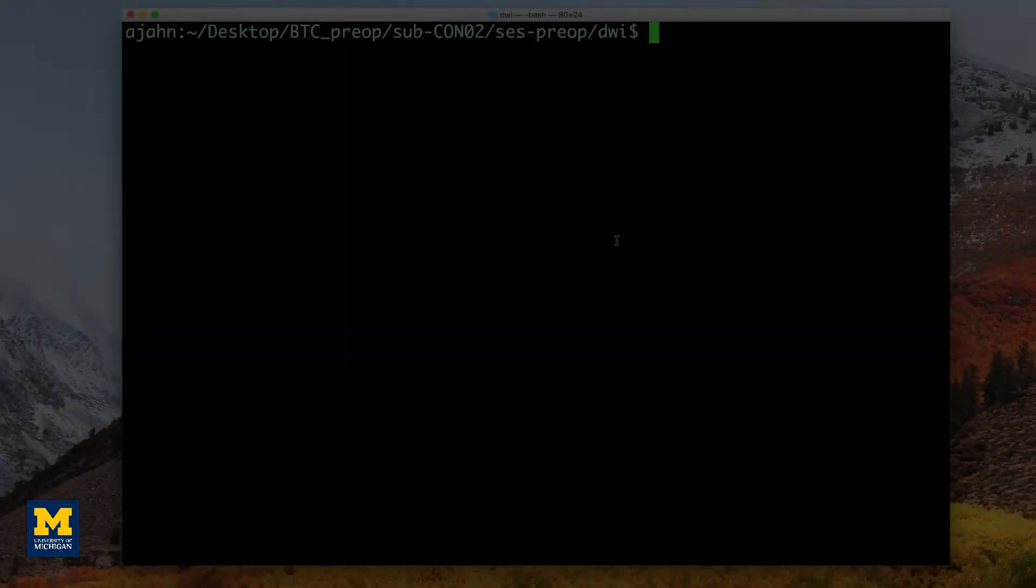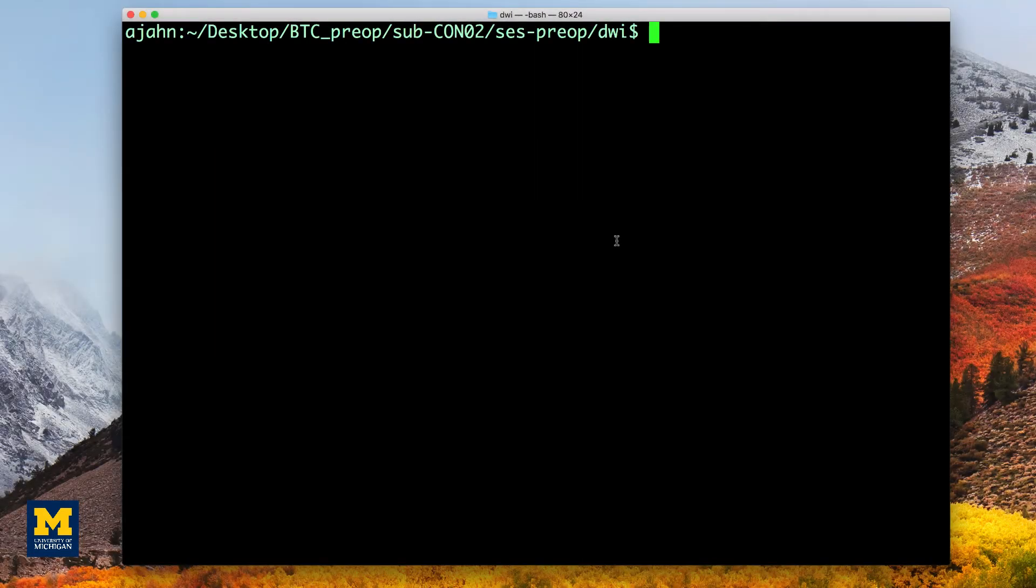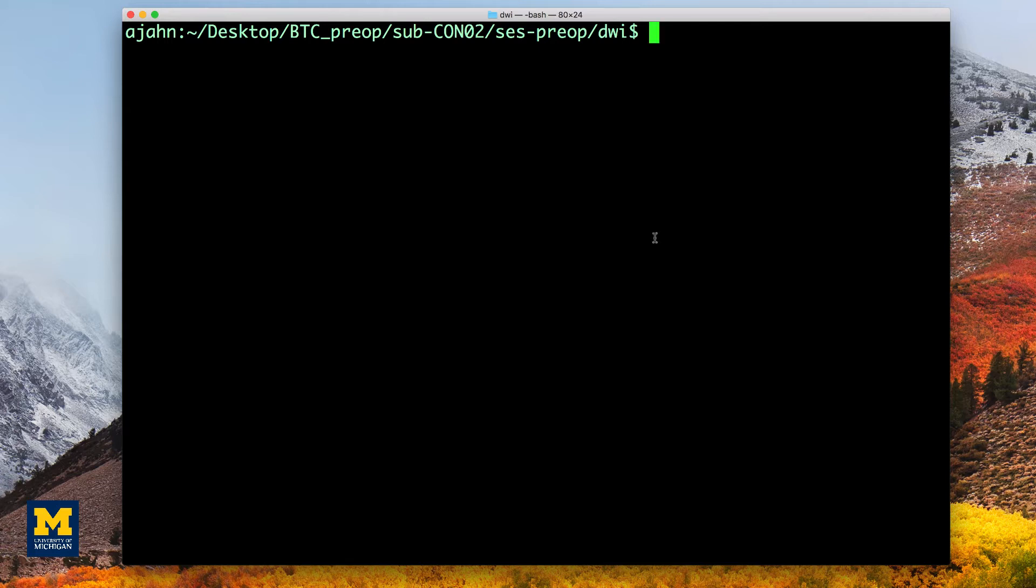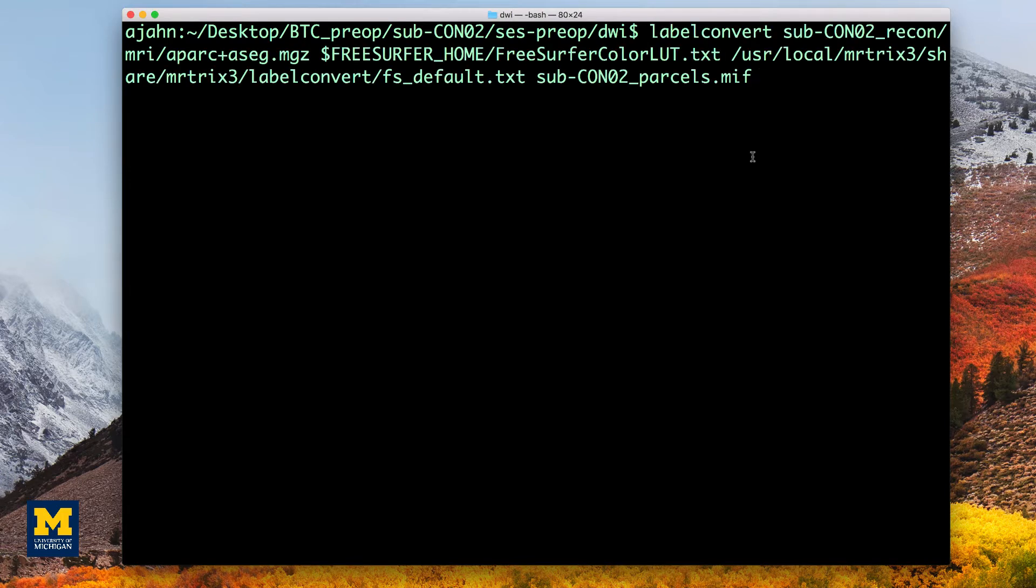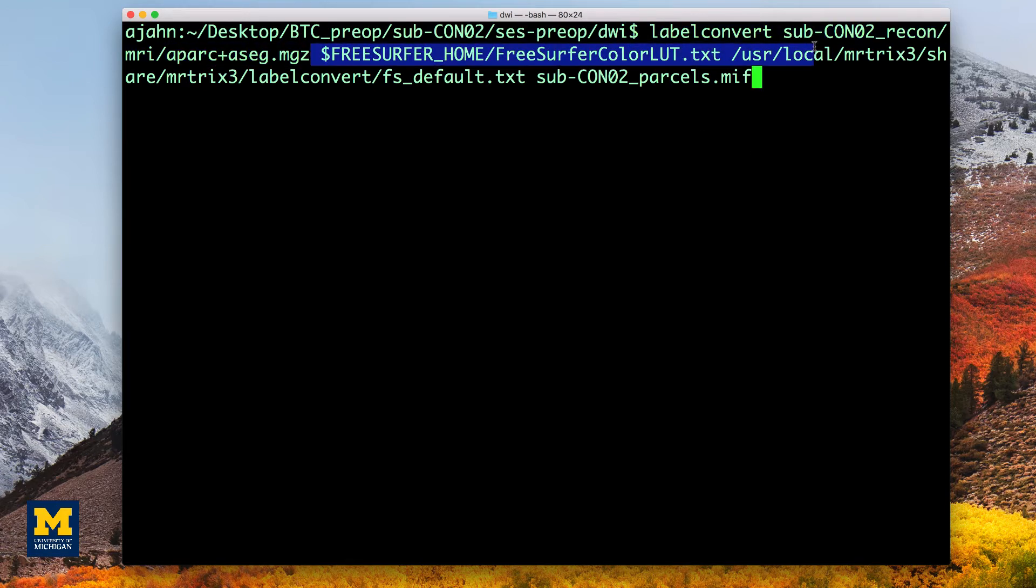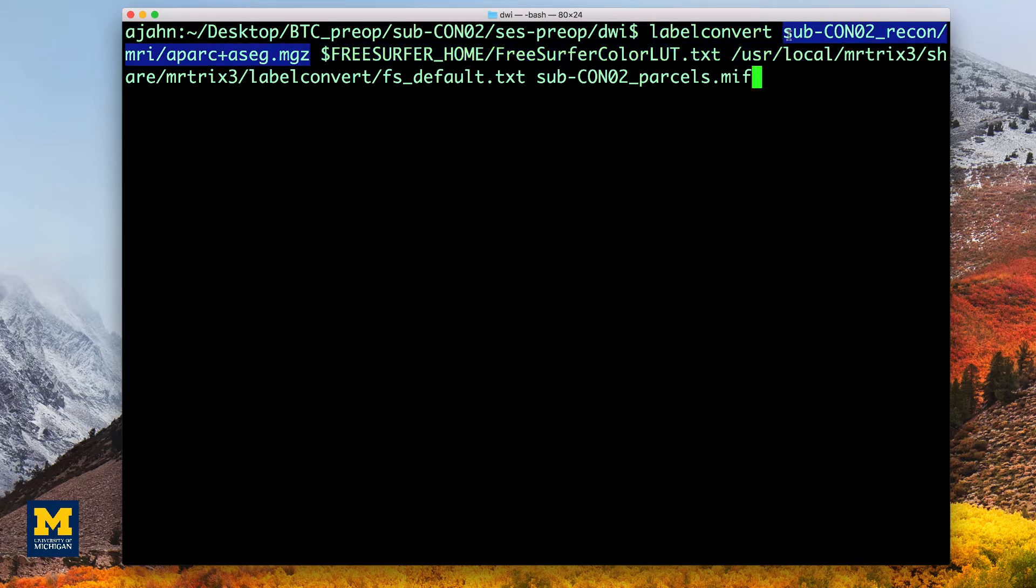When ReconAll has finished, we will need to convert the labels of the FreeSurfer parcellation to a format that MRtrix understands. The command labelconvert will use the parcellation and segmentation output of FreeSurfer to create a new parcellated file in .mif format. This command uses the aparc+aseg output from FreeSurfer, which contains both the cortical parcellations and subcortical segmentations.